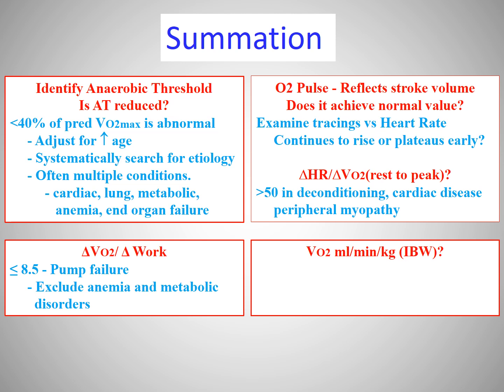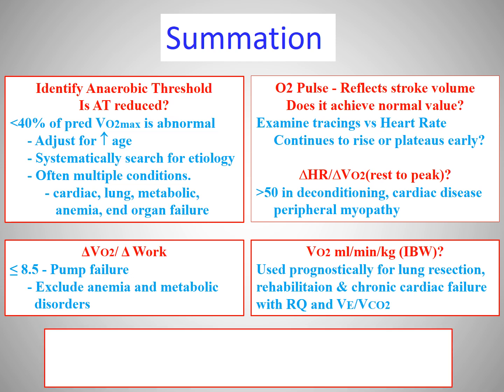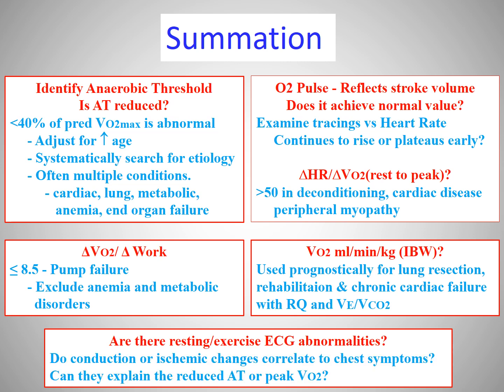And we also gave a quick overview of how the VO2 per kilogram can be used as part of the evaluation in patients with severe lung disease to assess surgical risk and in cardiac disease to assess risk of morbidity and mortality. And as a final comment, though we did not dedicate time to this subject since it is an entirely different series of lectures, we need to mention the importance of making sure one carefully monitors the electrocardiogram of each patient throughout exercise for specific electrical abnormalities that may help to explain the patient's symptoms. We find in our lab most patients with coronary artery disease are discovered by other more directed testing prior to the need for cardiopulmonary exercise testing.